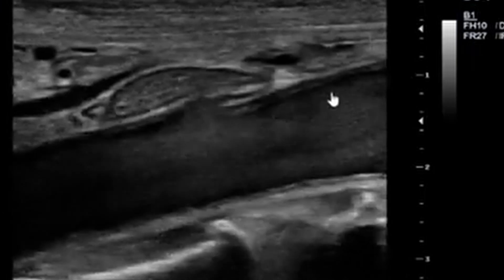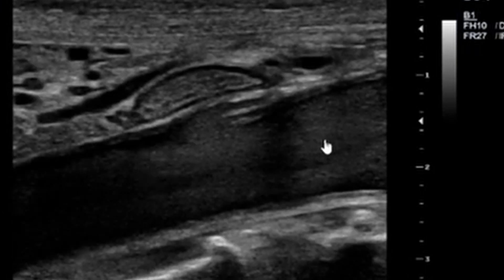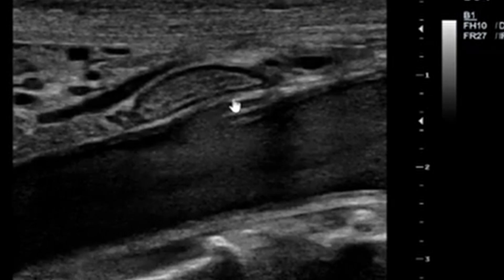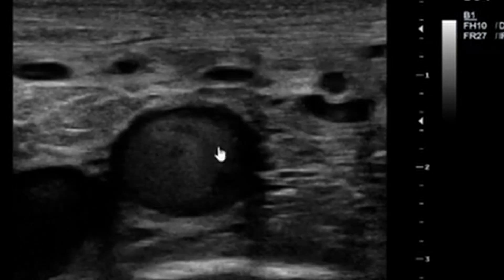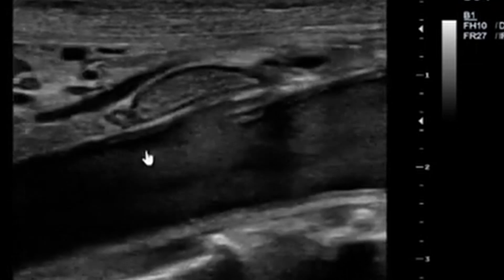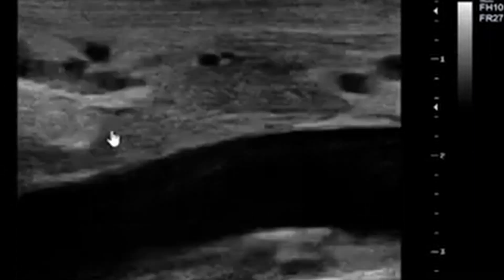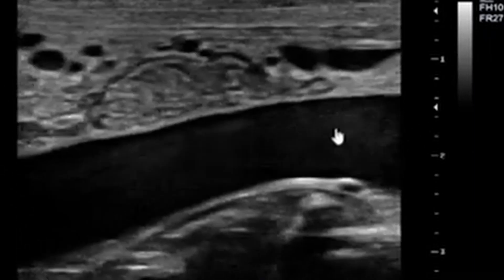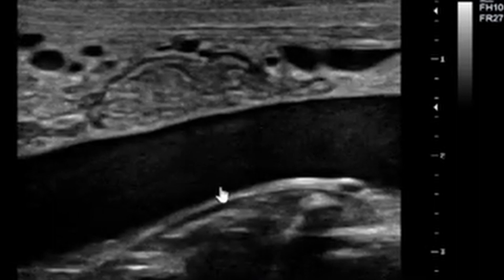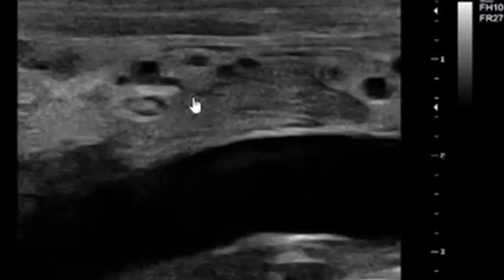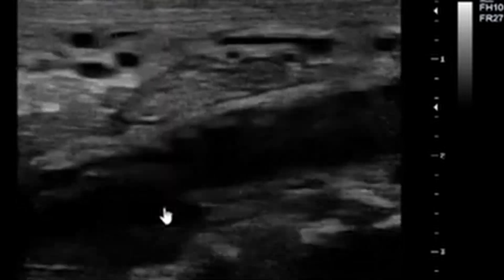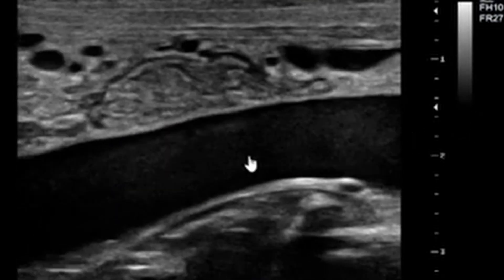Here is the aorta in longitudinal view, and you can see that the blood is more viscous and echogenic, in keeping with Rouleaux formation. What you have here is bowel with bowel contents, and here is our aorta. You can see the turbulence flow there.